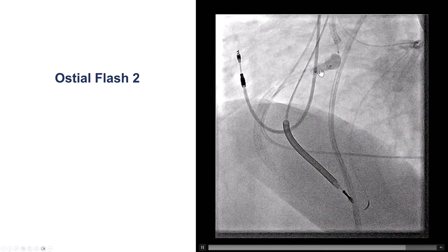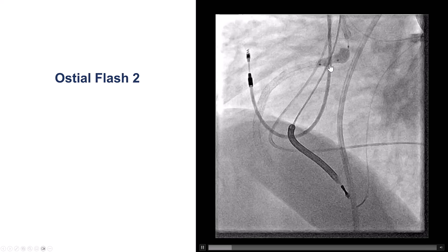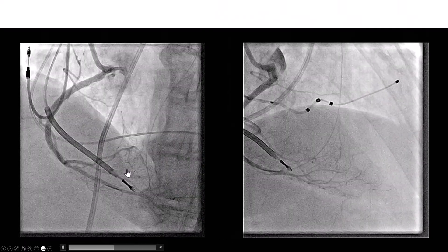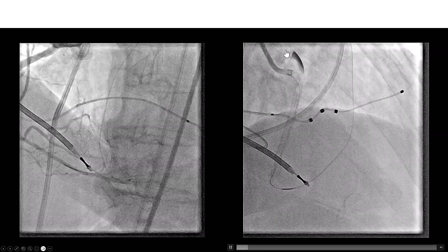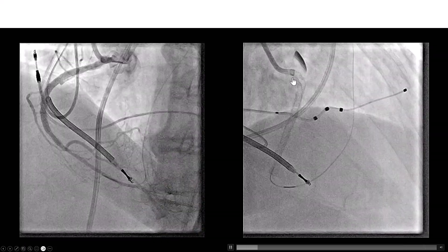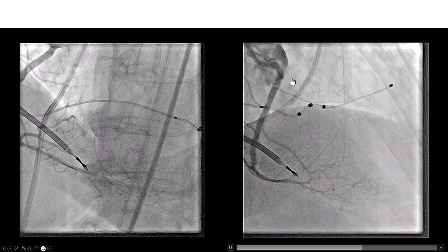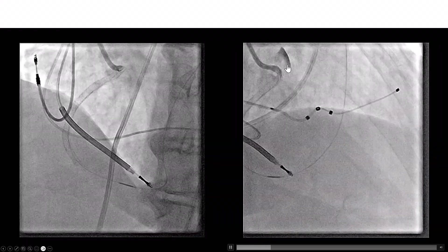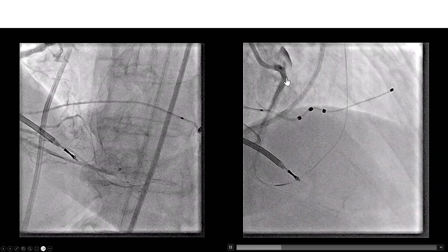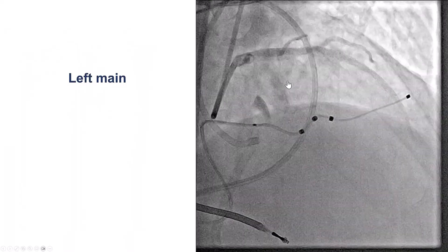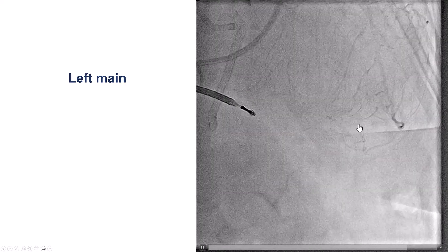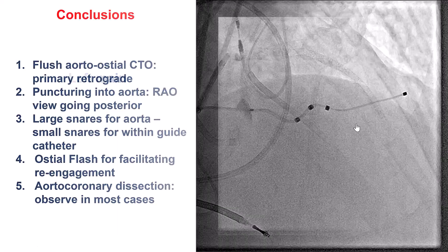This was especially useful in this case because we had the aortocoronary dissection. This is the final result — nice flow into the right coronary artery. We still have this small aortocoronary dissection. We don't do anything different for these dissections; we just observe them and make sure we stent the ostium and dilate it. These are usually absorbed by themselves. We then checked the left system and there was no injury to the left system during the procedure.